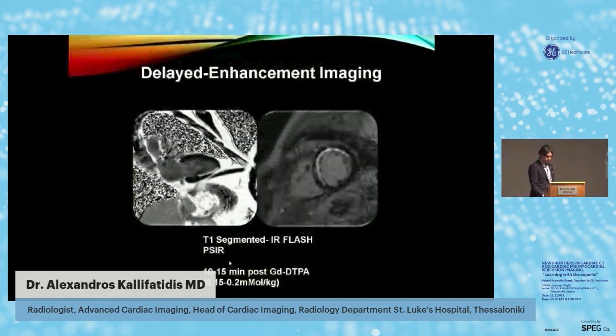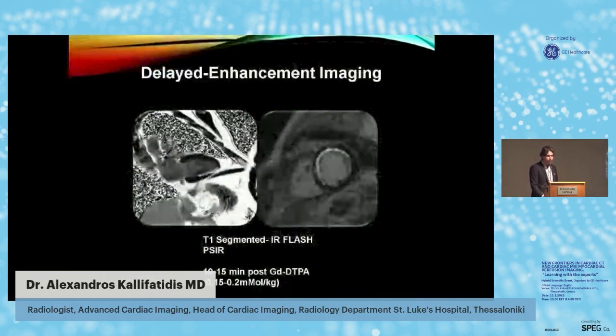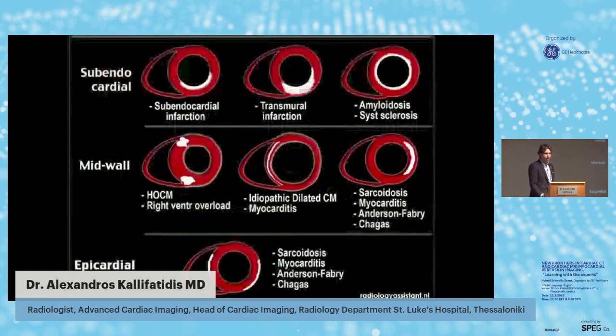We can see an extensive infarction in LAD territory, here in this area with the associated edema. In the other case here, much more extensive. We can see all this area, the infarcted zone, and inside this area, this dark zone, I will explain later on in what pathophysiologic feature this dark area corresponds, but we can see also the edema and also this dark area here inside the edema that corresponds to hemorrhage inside the infarcted area. And with late enhancement, we can see the extent of the infarction.